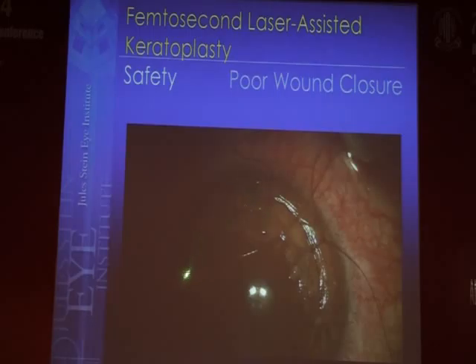I have the radial alignment marks to confirm I did not misalign the tissue. I think there was such a distortion of the donor cornea, though, during the trepanation, it just resulted in a very poor quality match. So I've now learned I really don't consider femtokeratoplasty for very, very steep corneas. If I had a femtosecond with a curved applanation plate, like the Femtec, then I might go ahead and do it. But with a flat applanation plate, I try to avoid these very steep corneas.